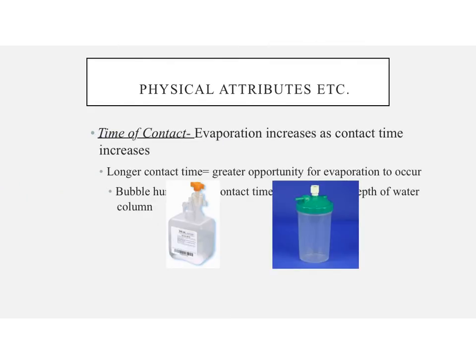So time of contact is the next physical attribute that will increase humidity output. So evaporation will be increased as the gas contact time with the water is going to be increased. So the longer the contact time equals the greater opportunity for evaporation to occur.